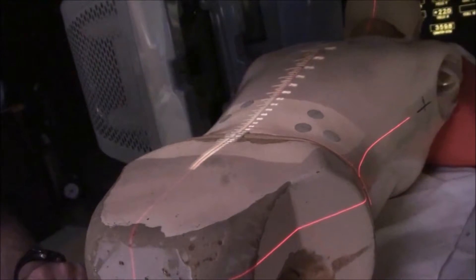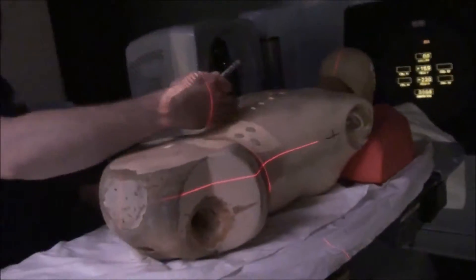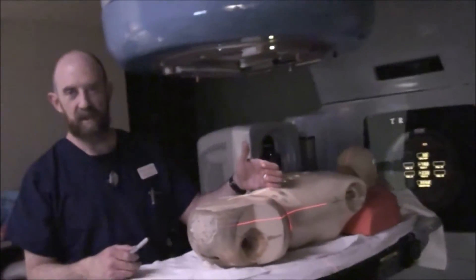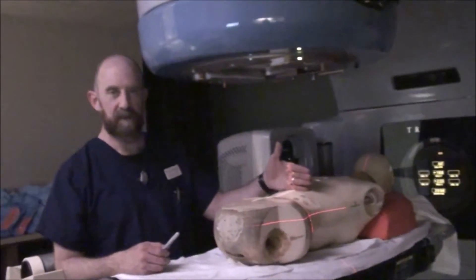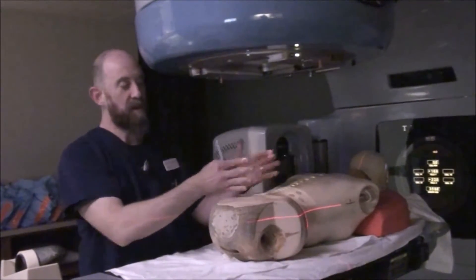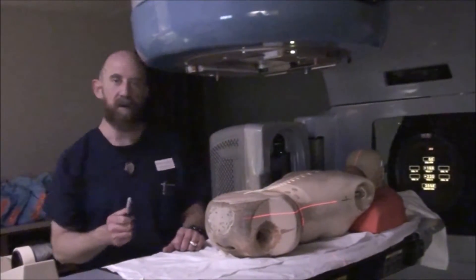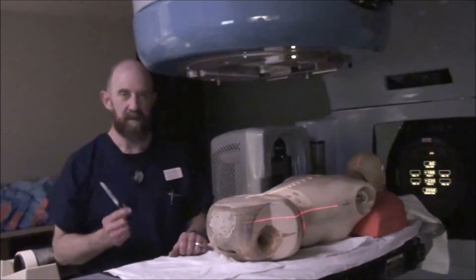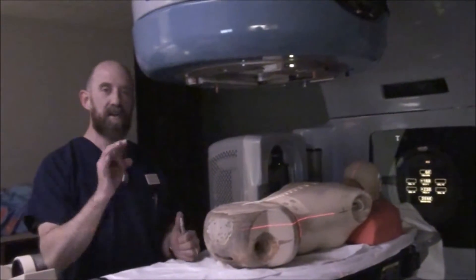With 95 SSD set and the field size ballparked, run out of the room and fluoro the patient. Make sure you've actually got the spine in the field. Adjust so the appropriate L-spine levels and the entire SI joint are included. Adjust the field size accordingly. Once you're sure of your position, call the doctor. The doctor will come in and make adjustments, and once everything is approved, notate everything.